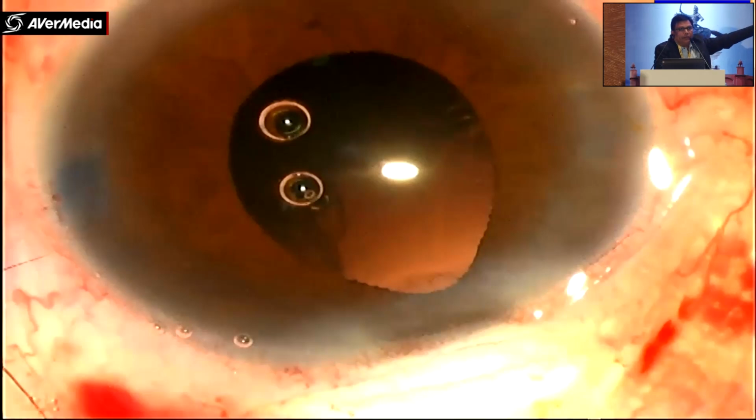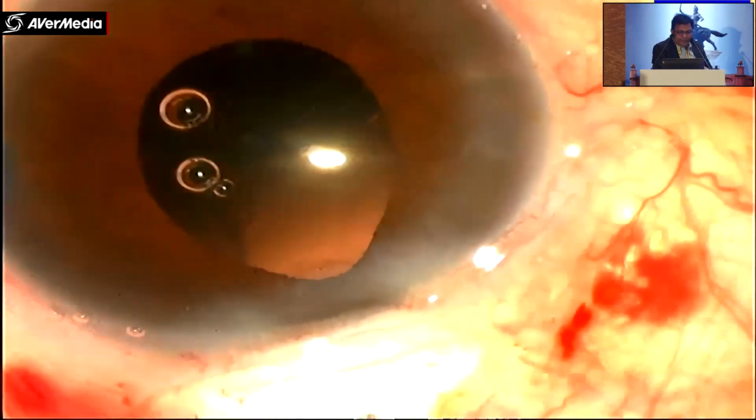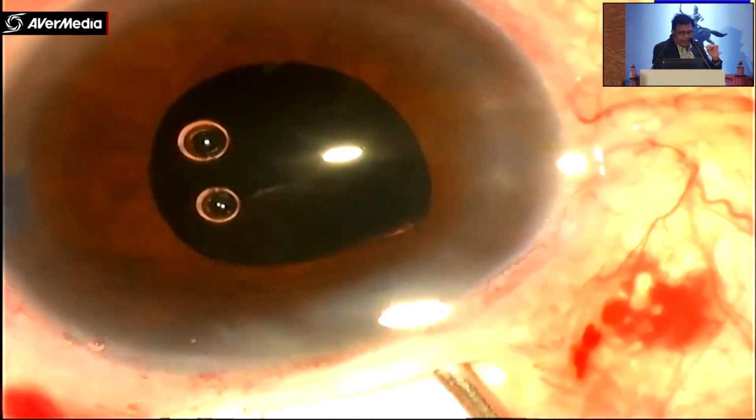If you think on this slide, there are many points. The doctor came out suddenly, and the position of the eyeball was not horizontal. So one slide will give you a lot of information if you watch. Even in my training program, I record the external hand movements of the doctor. External hand movements give a very good idea of exactly what speed he has come out at, and how he is coming out: straight, or planning parallel to the iris. So this picture helped me realize you can manage the iris.